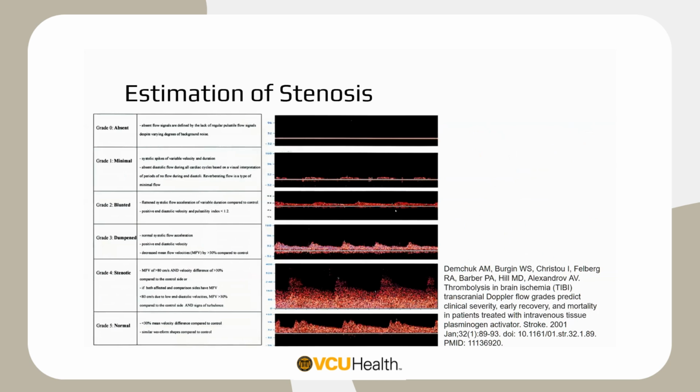Another framework for this has been the TIBI grades, from Dr. Alexandrov. This is a semi-quantitative method where you're using waveform characteristics to give a grading.